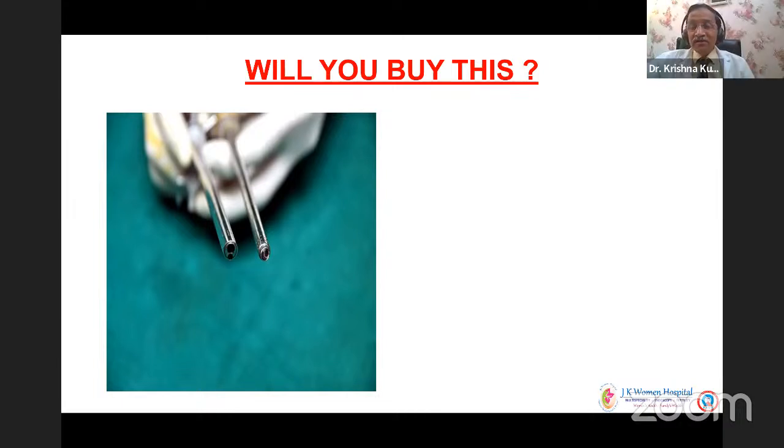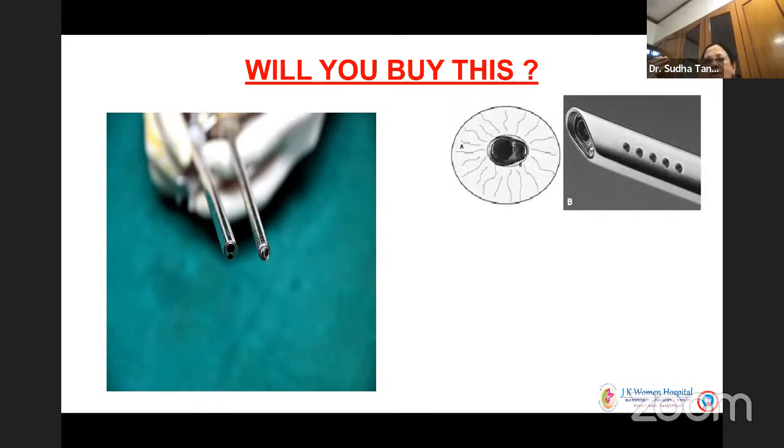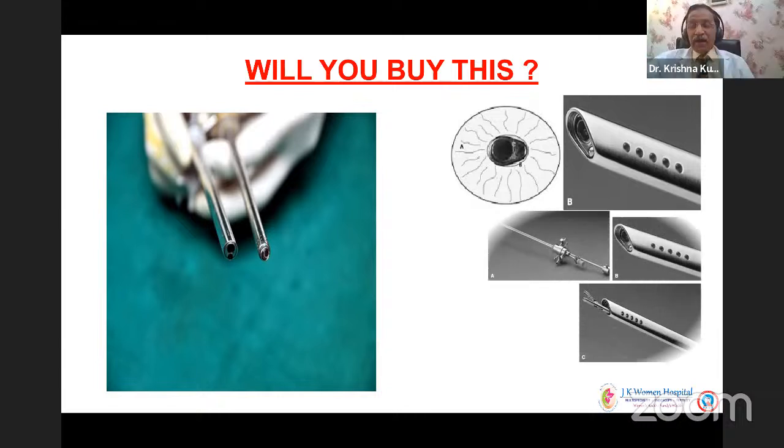Will you buy this today? The new hysteroscopic surgeon wants to know what to buy, so the challenge is for us to advise. I think the time has come where the vision with the 2.9 mm hysteroscope is very good, and it is also not a rounded tip. I don't think there is any need to buy a 4 millimeter hysteroscope, unless you are in a transition phase where you cannot afford the 2.9 mm. Very rightly said, one should not buy 4 mm now. I see even big corporate hospitals continuing to use the 4 millimeter telescope, which absolutely kills the art of hysteroscopy. So 2.9 with the Bettocchi operative sheath, which is just 5 millimeter, is the one you should buy.